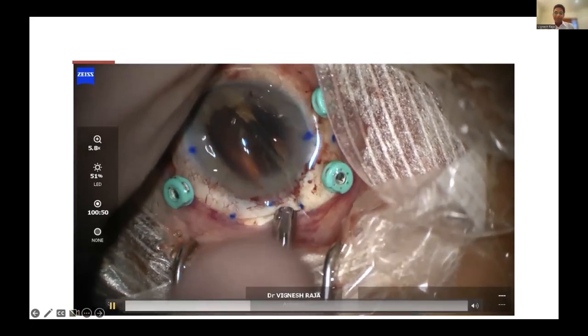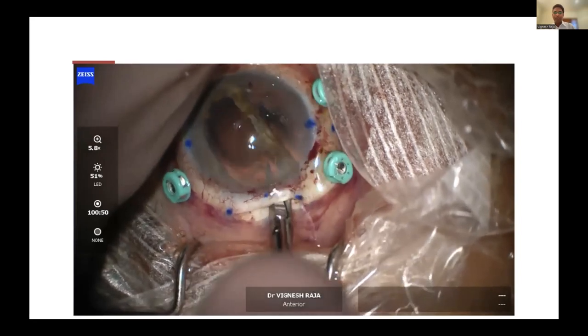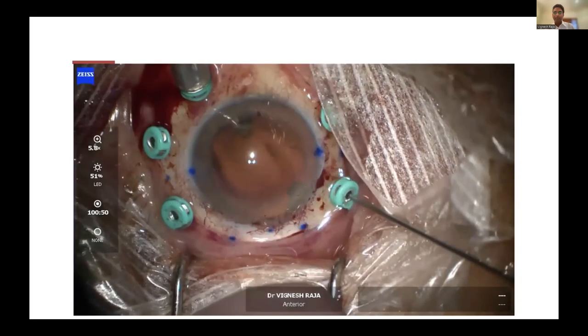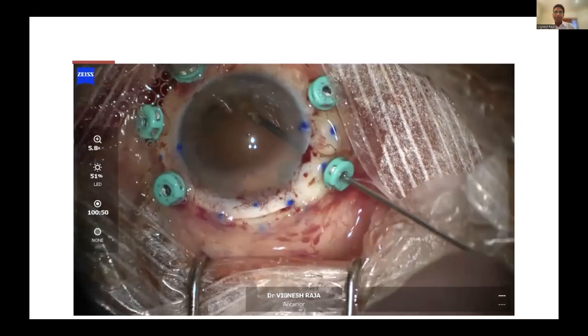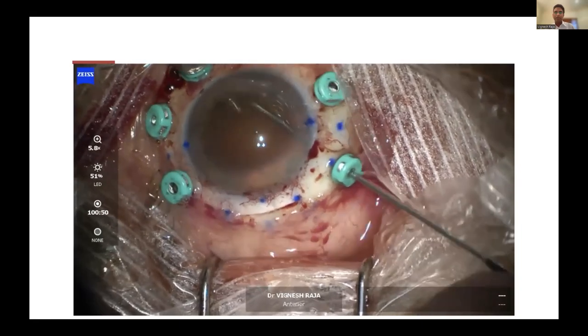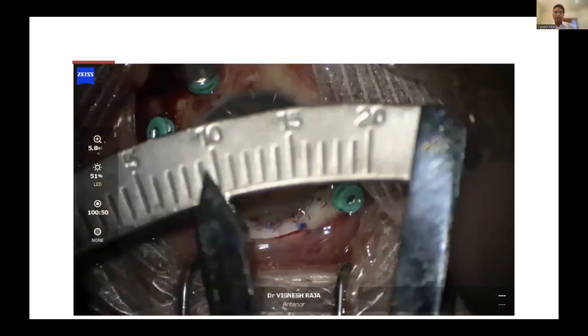So now what I'm doing is I'm cutting off that stump, but I have the intraocular diathermy on standby, just so that if the iris bleeds or anything, I can use the intraocular diathermy to cauterize the stump.